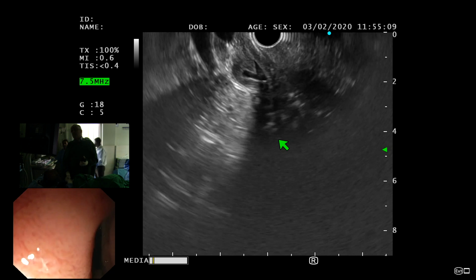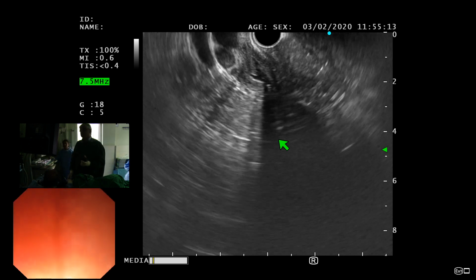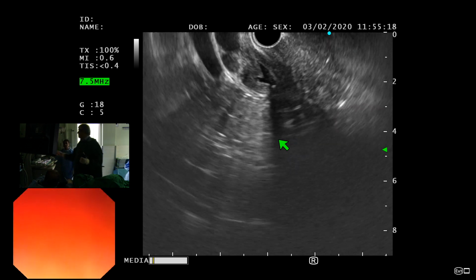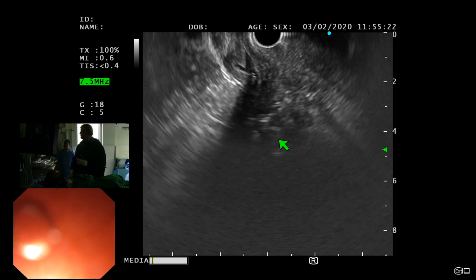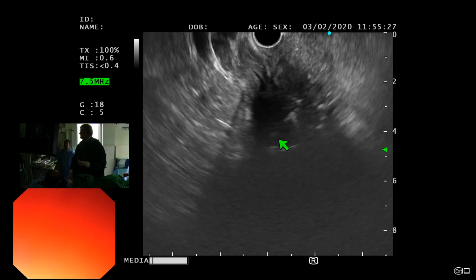Is that air in the stent? Yes. So the stent is kind of getting lost there, but it is somewhere in the background. No matter, I've tried whatever options. Yeah, I see that now, and I think you need to do an FNA of this area.